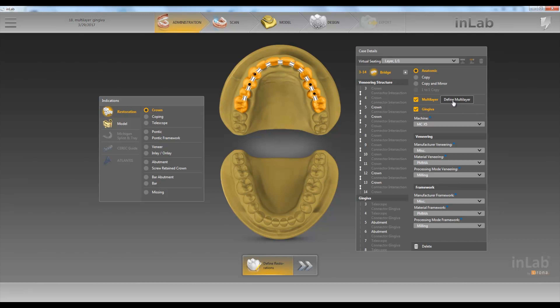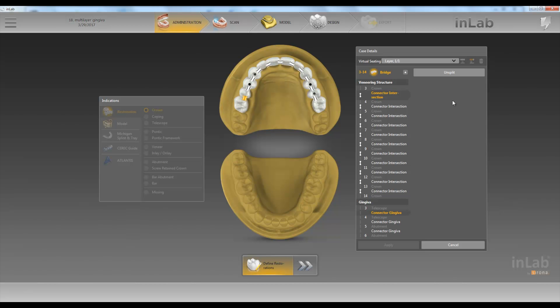The framework can be out of PMMA, Lucitone 199, Trilor, whatever you want. And the top can be out of the same — whatever you want it to be.